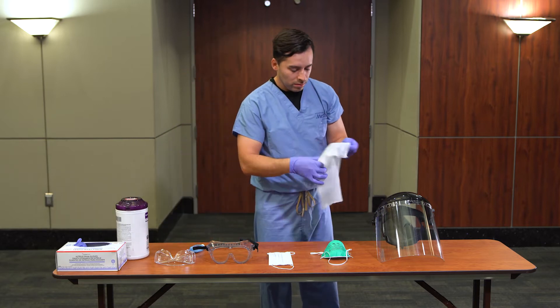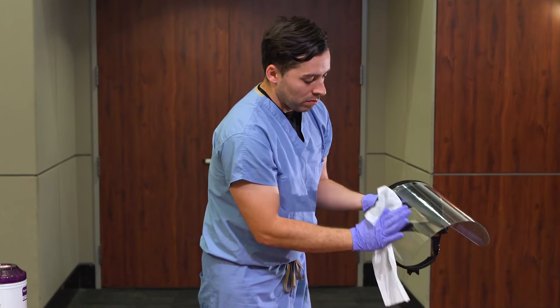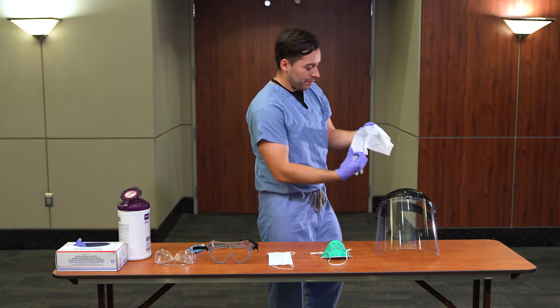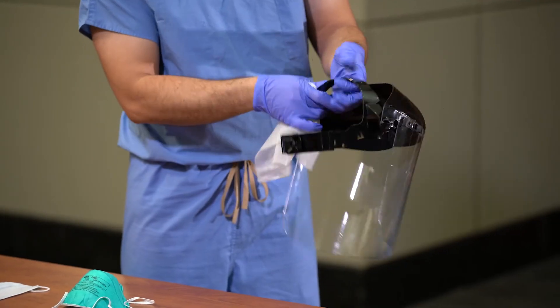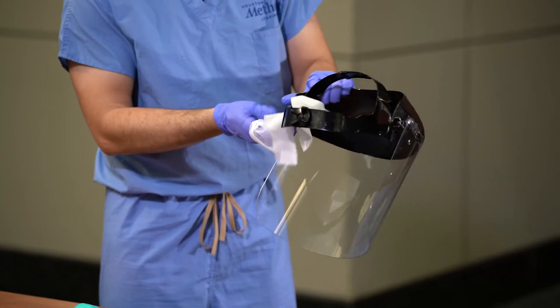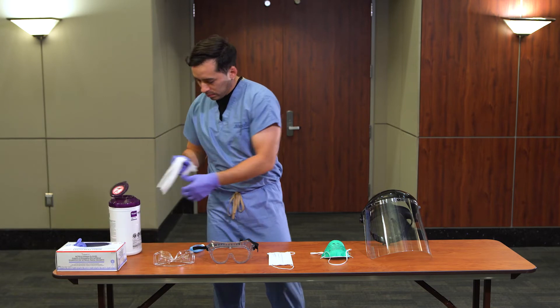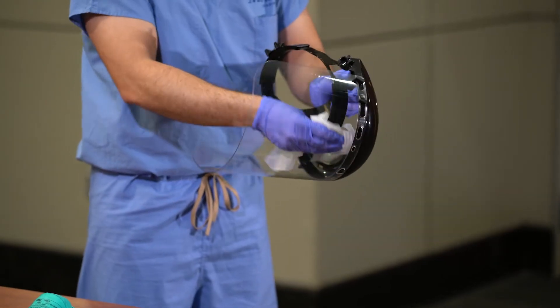Start by wiping the exterior of the shield. Discard the wipe. Wipe the interior of the shield. Wipe the harness. Discard the wipe. Once disinfected, store the face shield on a clean surface.